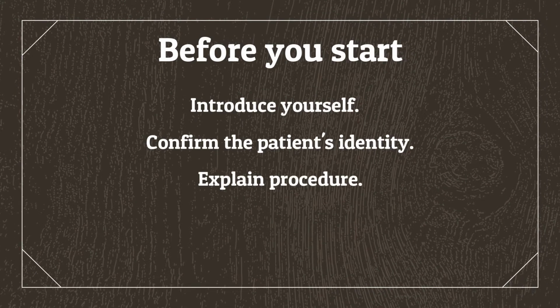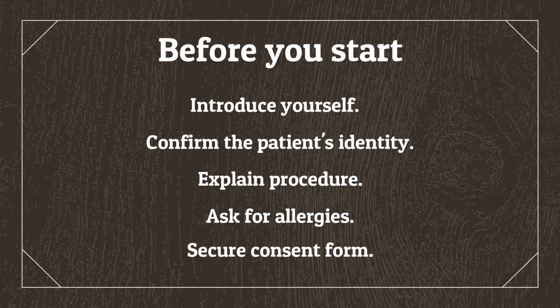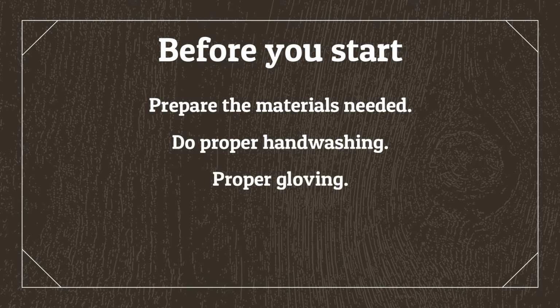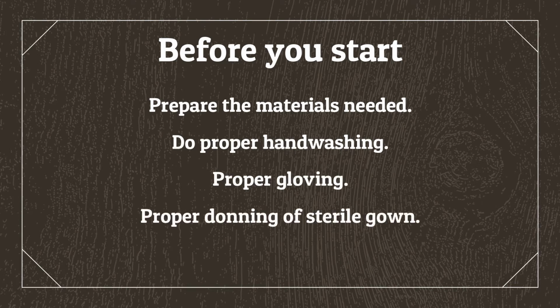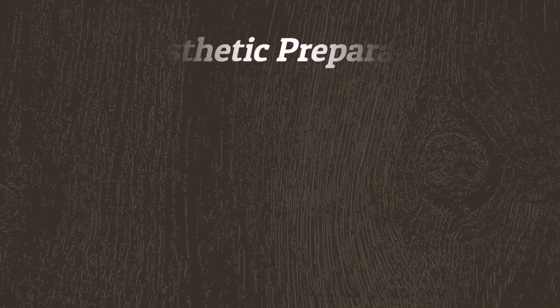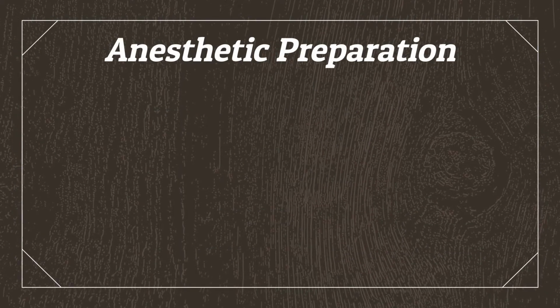Explain what you are about to do, ask for any allergies, secure consent form, prepare the materials prior, do proper hand washing, proper gloving of hands, proper donning of sterile gown and proper draping of the site. Calculate for the proper dosage of the anesthetic to be used.